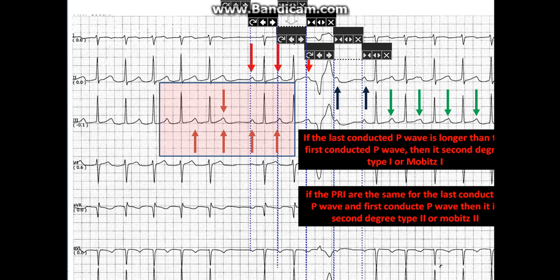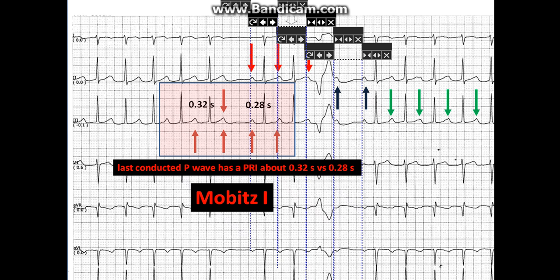In this case, the last conducted P wave had a PR interval of about 0.32 seconds versus 0.28 seconds for the first. Thus, this is second-degree type 1, or Mobitz 1.